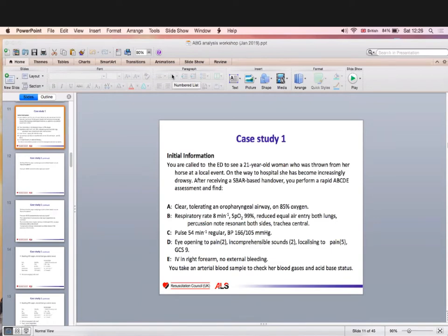pH 7.25. Okay. pH is 7.25, then PCO2 60. Okay, 60. PO2 100, 150.